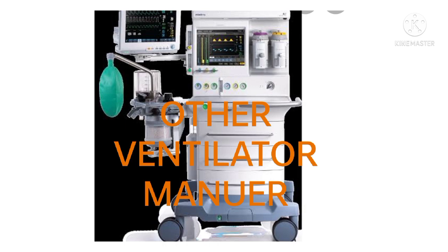PEEP is titrated to the point at which oxygenation improves without compromising hemodynamics. This is termed optimal PEEP. Often 5 cm H2O PEEP, referred to as physiologic PEEP, is used prophylactically to replace the glottic mechanism, help maintain normal FRC and prevent alveolar collapse. PEEP improves gas exchange, vital capacity, and inspiratory force when used during weaning.